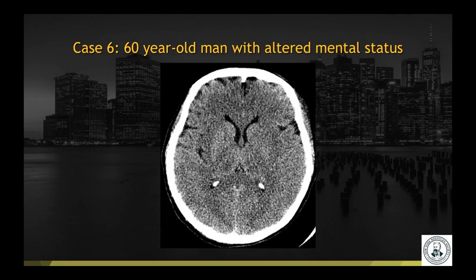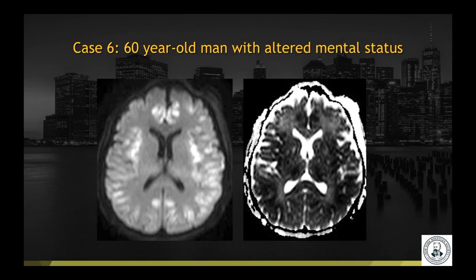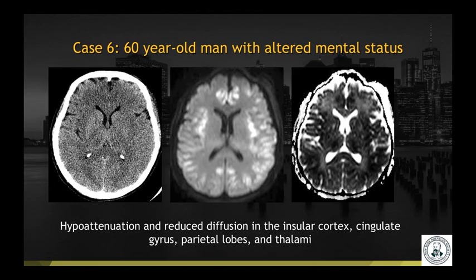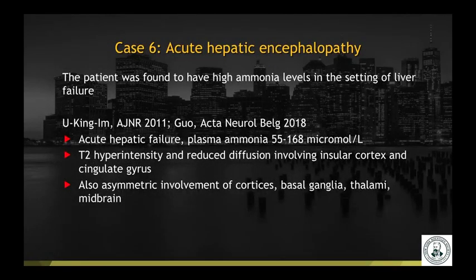Case number six: a 60-year-old man with altered mental status. Non-contrast head CT, diffusion, and ADC map demonstrate hypoattenuation and reduced diffusion involving the insular cortex bilaterally, cingulate gyri, parietal lobes, and thalami. This was a case of acute hepatic encephalopathy; the patient was found to have high ammonia levels in the setting of liver failure. This imaging distribution has been described in the literature, although you can also have asymmetric involvement of other areas of the cortex, the basal ganglia, thalami, and midbrain.